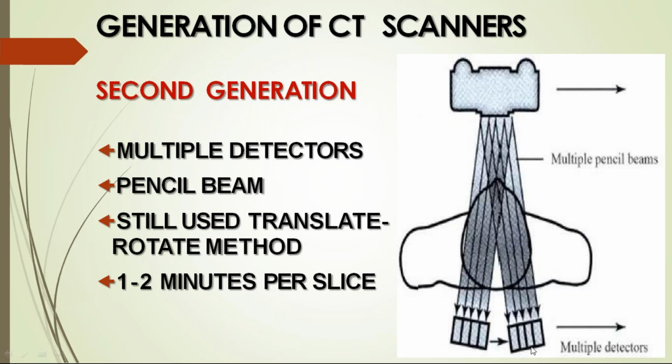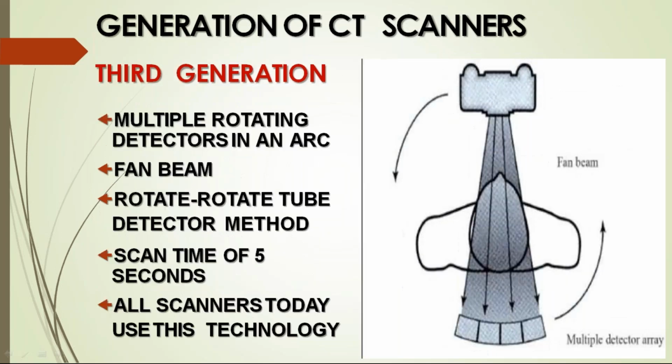You can see multiple detectors here, and multiple rotating detectors here.